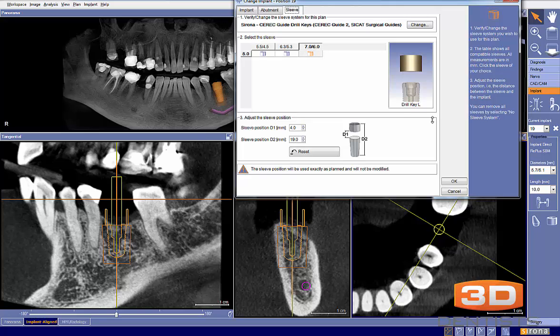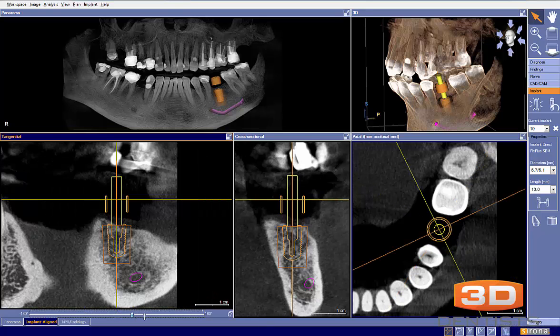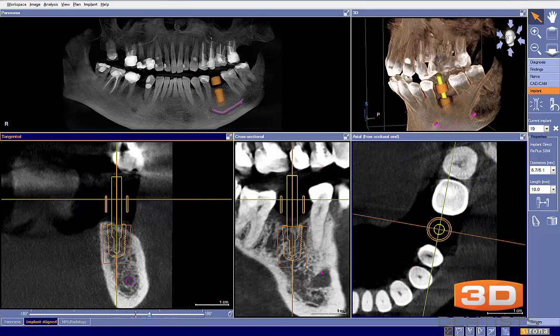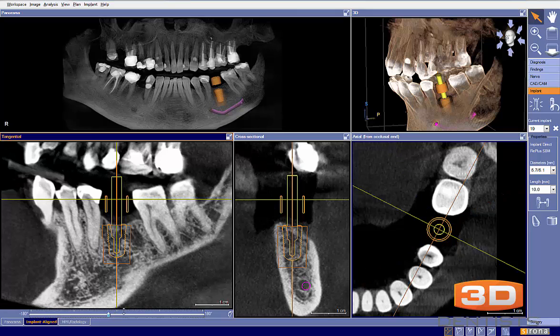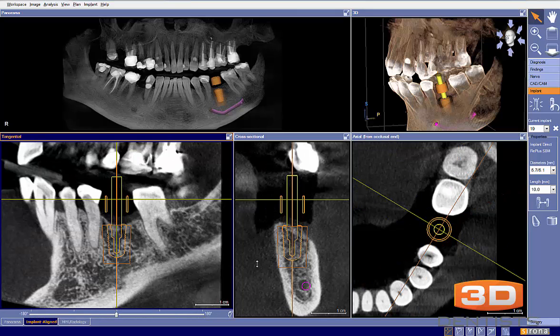Now we have everything in place and everything looks good from here. Let's do our 360 view. We can see how everything looks — we don't have any bone dehiscences, and everything's pretty straightforward.